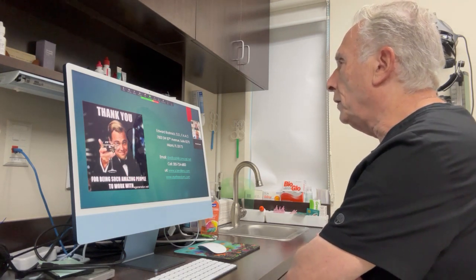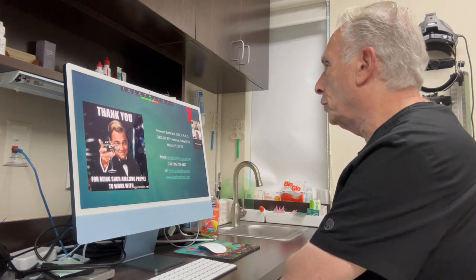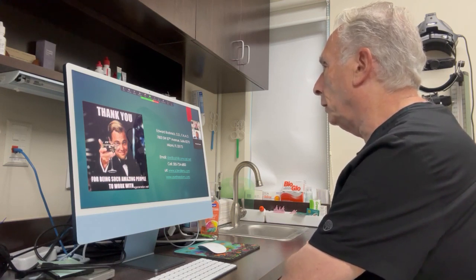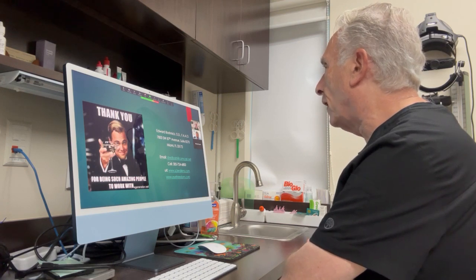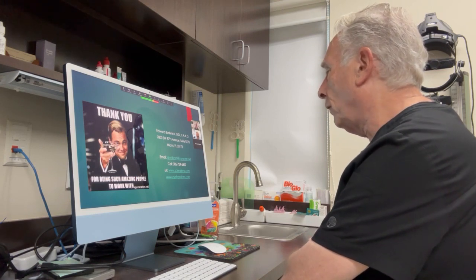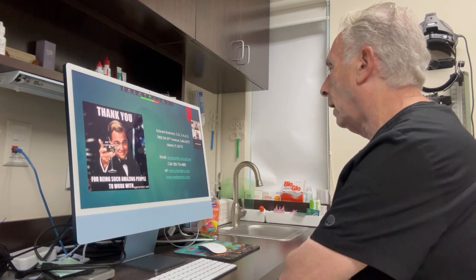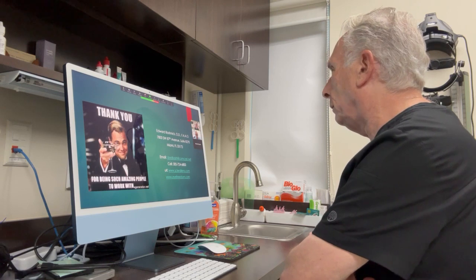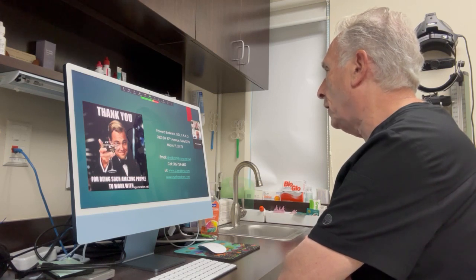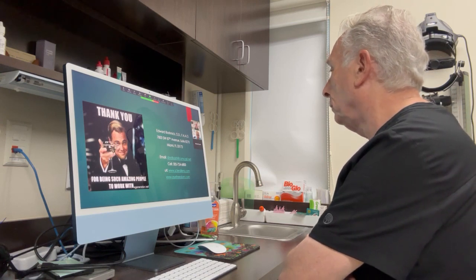Yeah, I think there might have been some isolated cases where there was increased intraocular pressure after wearing scleral lenses. I have not seen that. We check everyone, their pressure before, we do it during their fitting period, and when they do come in for follow-up visits, we check everyone's pressure with several different pieces of equipment. So I've never witnessed this. I think maybe it was documented in one or two cases, and a case presentation was done in a journal, and next thing you know, the internet comes up with various theories. I don't think it's a real thing. I don't really think it's an issue.